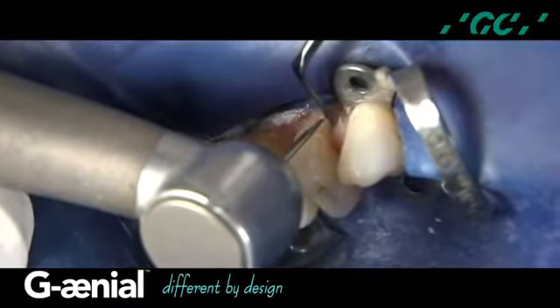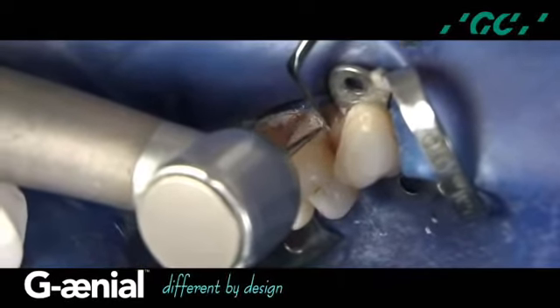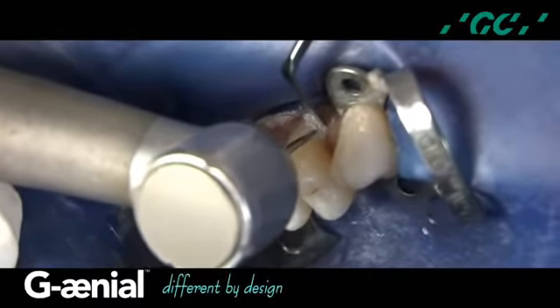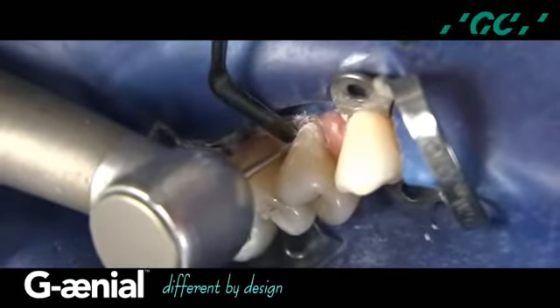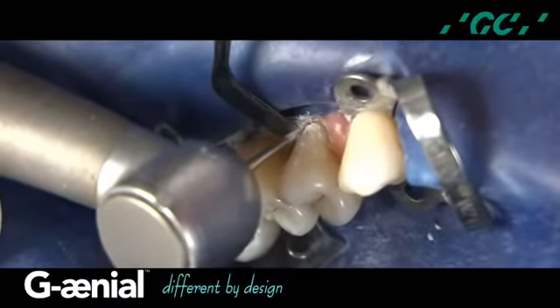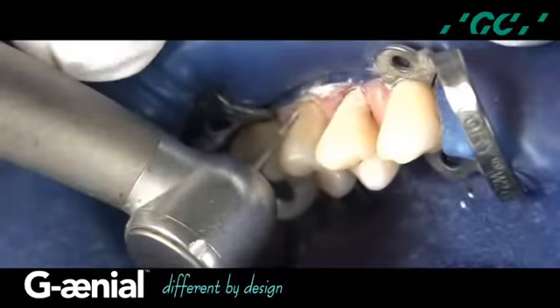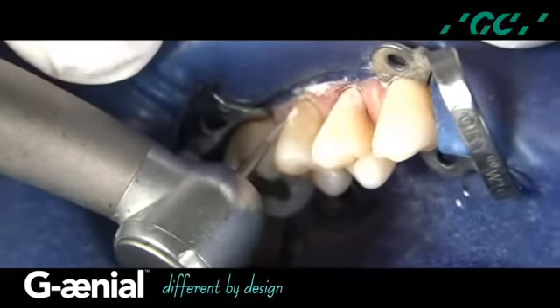Finishing and polishing directly affect the aesthetic qualities of color and gloss of directly placed composite restorations while increasing their longevity. Finishing is accomplished with a DET3 needle-shaped diamond finishing burr by Brassler. It is important to reflect the gingiva with a number 8 instrument by Euphredi to prevent tissue laceration. A long tapered 8-micron DET6 finishing diamond by Brassler is used to finish the coronal interface and maintain the natural anatomic facial contour.